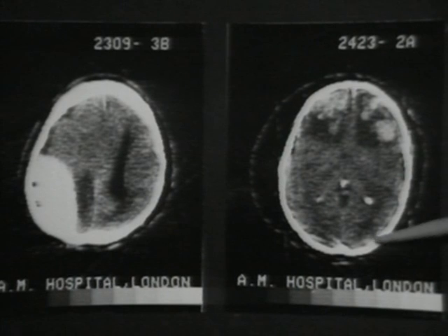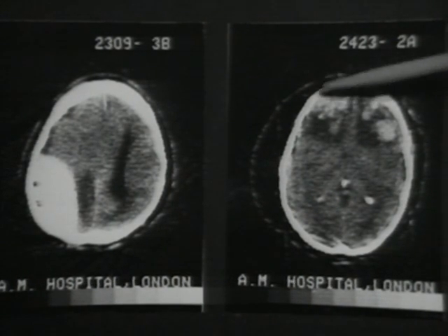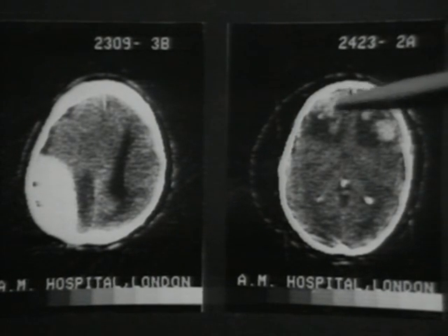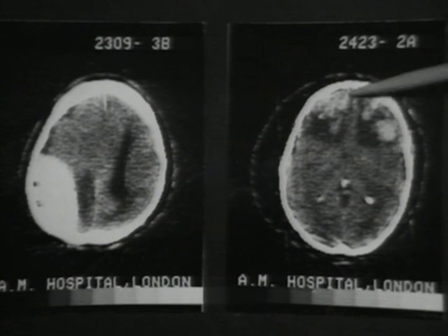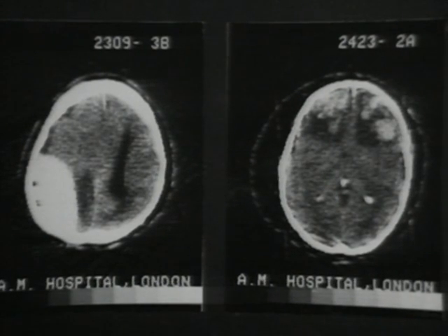The EMI scan gives us the answer, because here in the frontal lobes we can see this patchy increase of density, which looks like segments of cauliflower, surrounded by darker areas, which are obviously edematous brain. This is frontal lobe contusion, in fact a contre-coup injury.